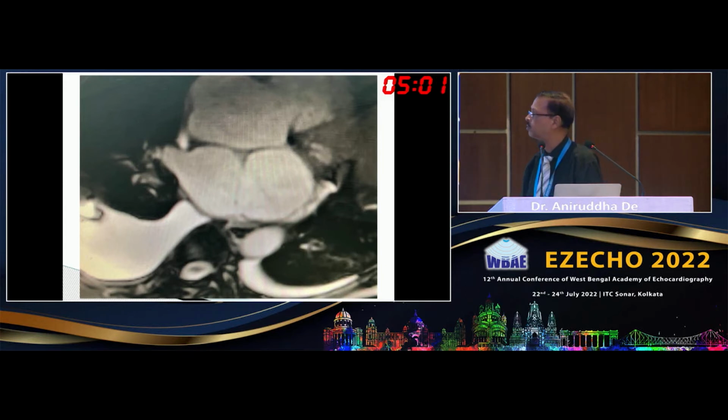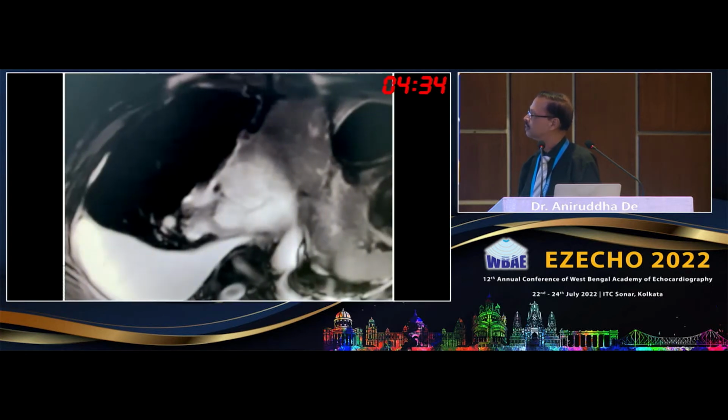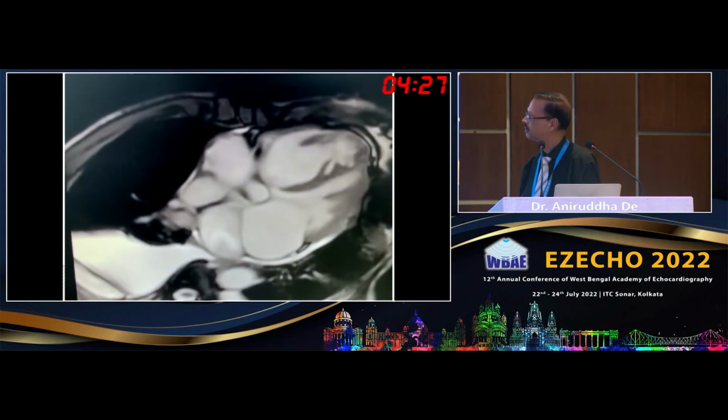We did the CMR to confirm it in this 75-year-old man. We didn't do the transesophageal echo; rather, we went to the CMR to confirm this. So this is the CMR view, and you can describe this CMR in a better way. I have 3-4 clips, and this is another clip, the cine. There are two cines, and I'll just show them, and then you can describe.